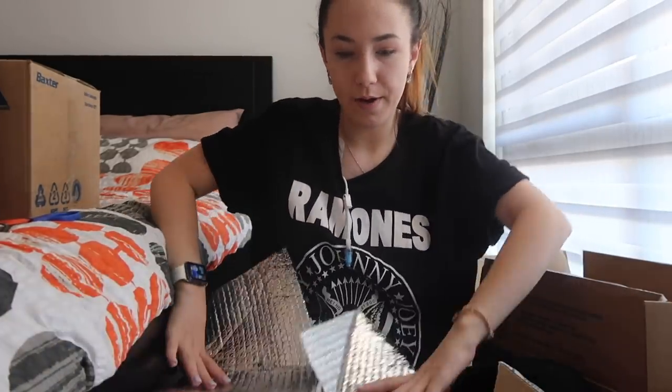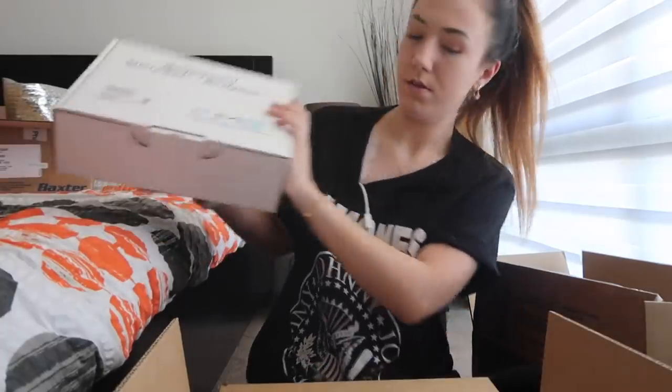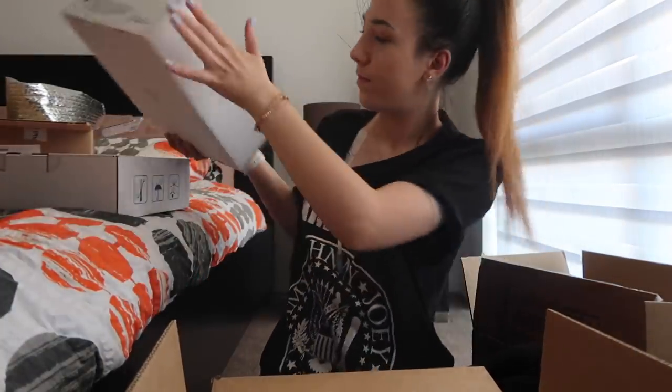I'm just going to leave those on top of the IV fluids because we're going to be taking those in there to put them away anyway. I'm not particularly sure what's in this next box because these three are just medical supplies - I honestly cannot remember what I ordered so we're going to find out. These are giving sets, and by giving sets I mean body sets. These are the tubing that connects from me to my TPN. So we have two of those.